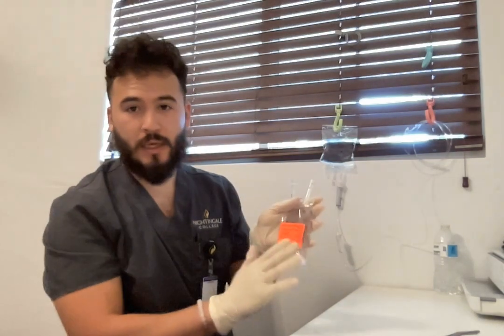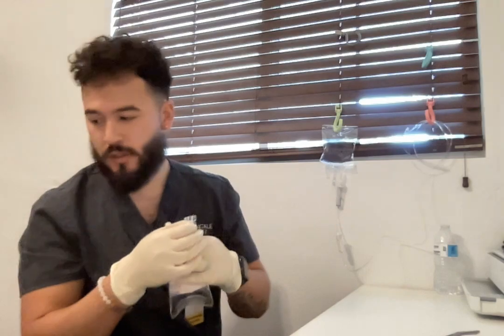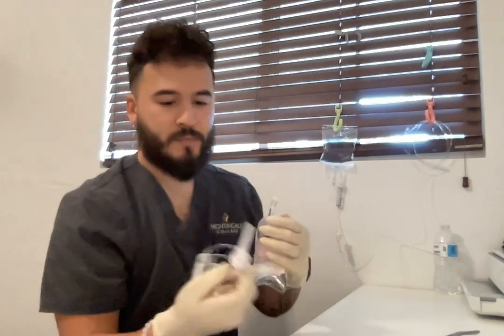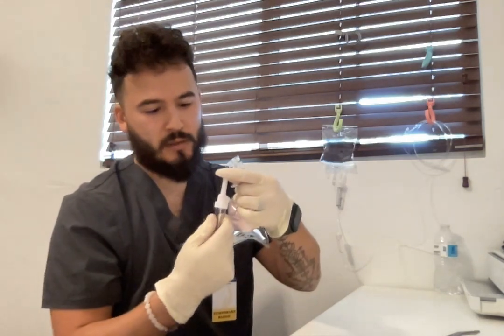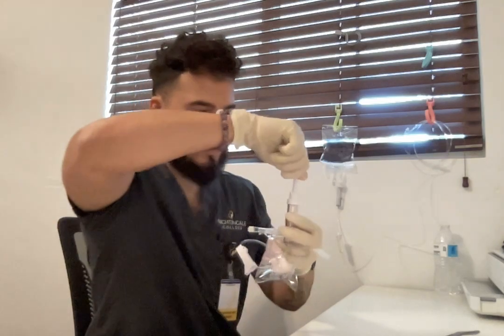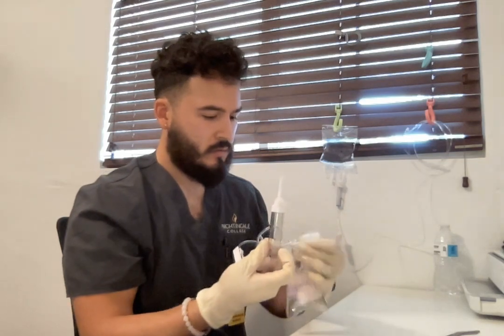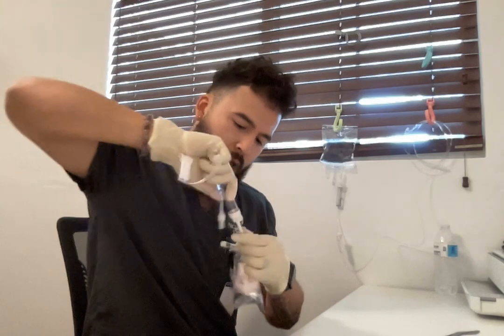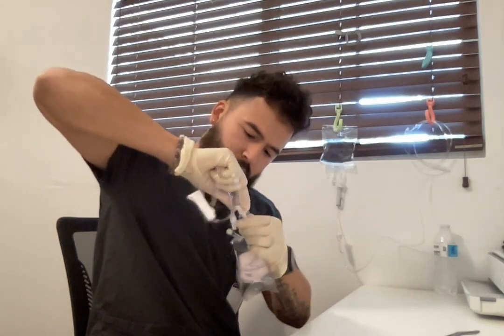So we have our medication label to identify the correct patient. I've also removed the cap on here for the sake of, well, it's a little hard to remove. So same process. I have the sterile spike. So I'm gonna remove this, leave it right here. Okay, now I'm going to puncture the bag. Get it all the way in there.